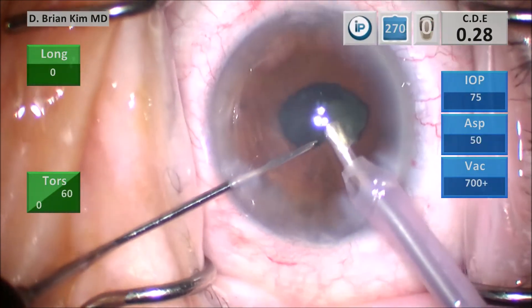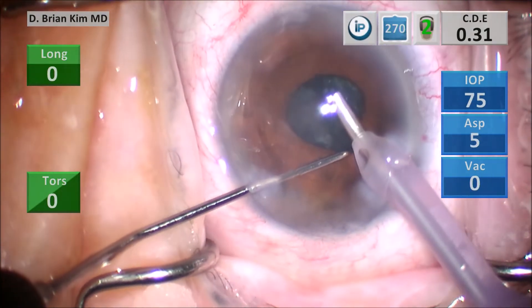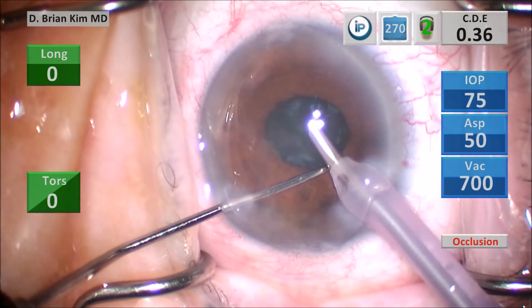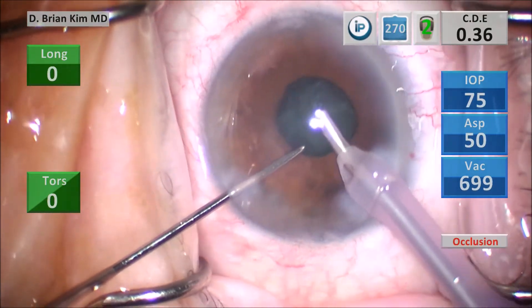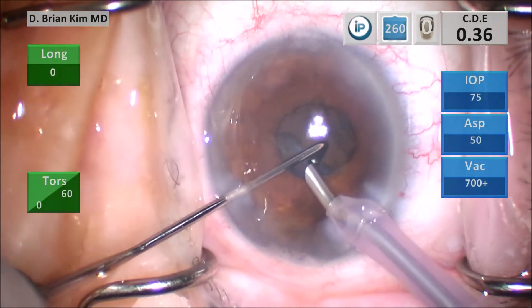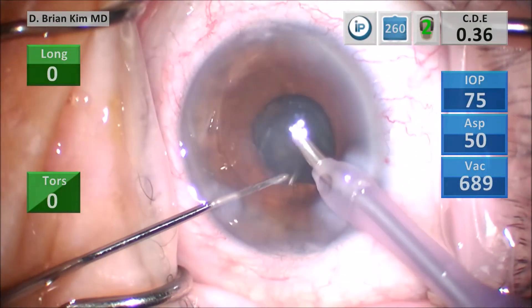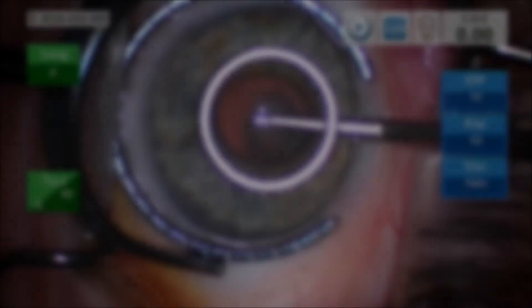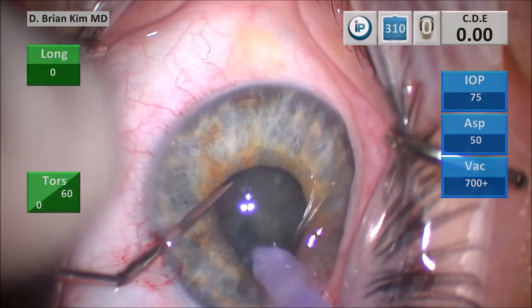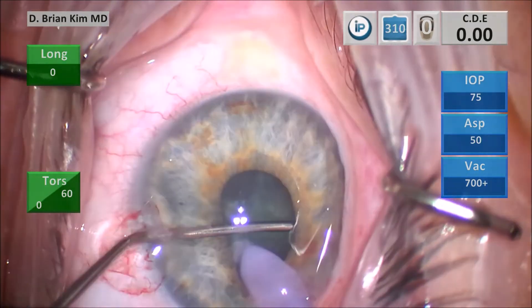You can see here this is quite a floppy iris — this is truly an IFIS case. The iris is really trying to come into the port and I have to use my chopper to hold it back. I'm pulsing and feathering the pedal, so I'm not causing any iris damage. It went into the port but I didn't apply any ultrasound energy to the iris, so there shouldn't be any damage or iris defects. Because I'm not as dependent upon using ultrasound vacuum with this technique, I am less likely to cause damage to the iris with these small pupils. I broke the lens in half using mechanical forces and then break the right hemi nucleus again with mechanical forces.